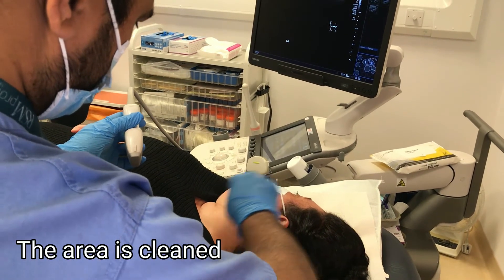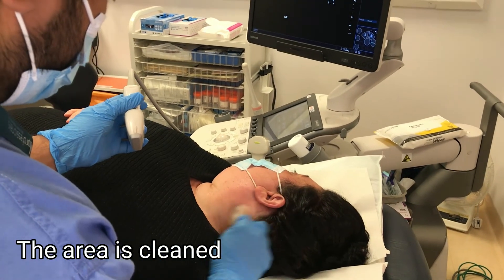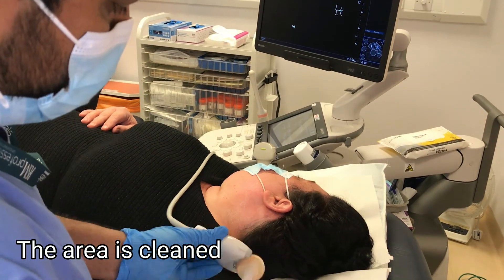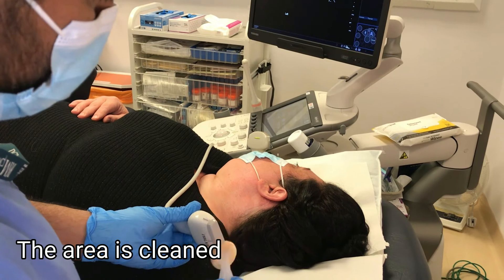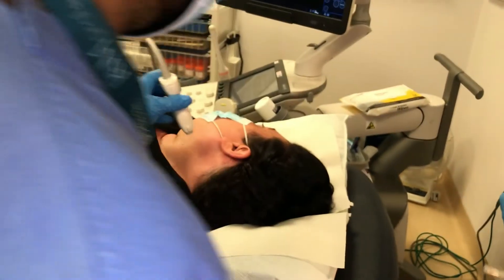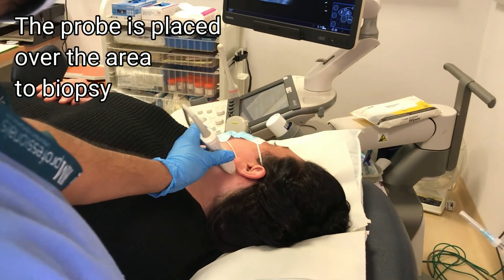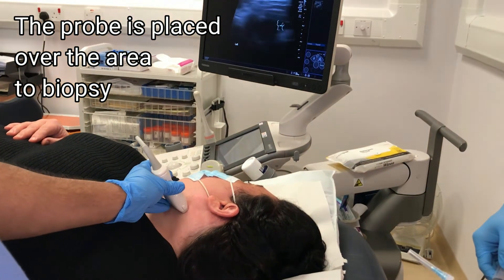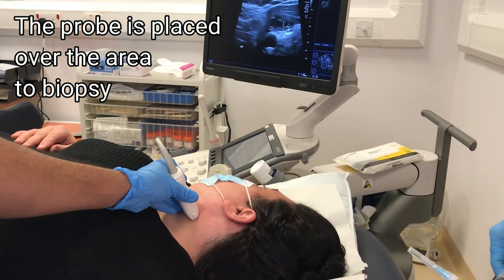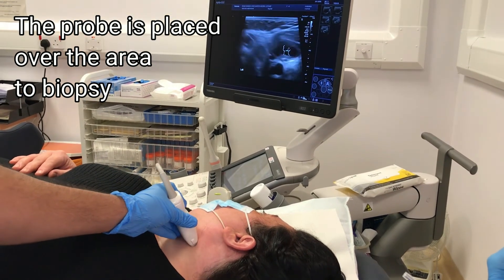The area of the neck from where the biopsy is going to be taken is cleaned, as is the probe itself. The probe is used to help take the biopsy, in order to increase the likelihood of a conclusive result.